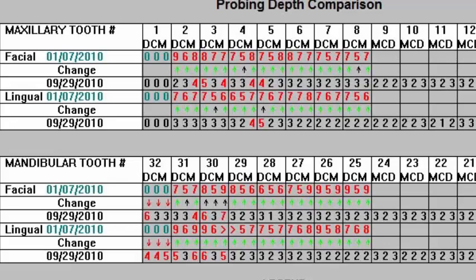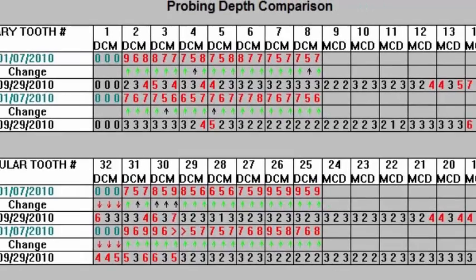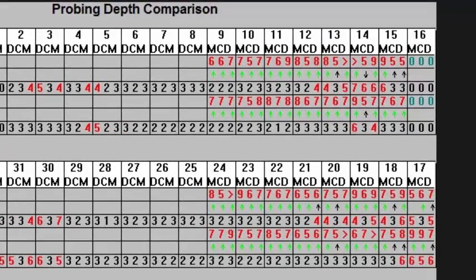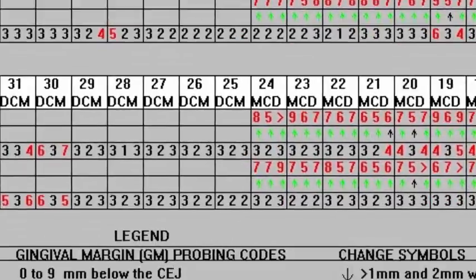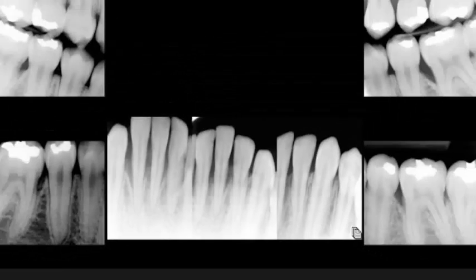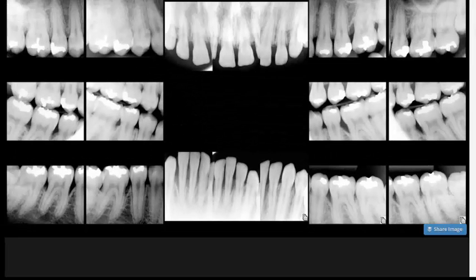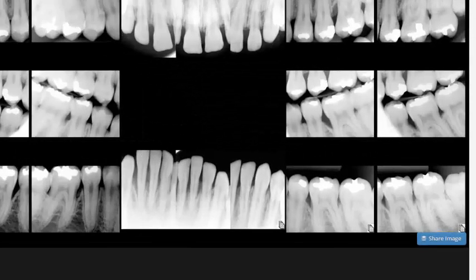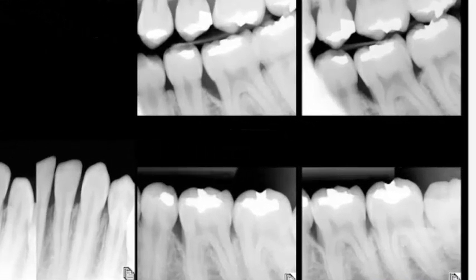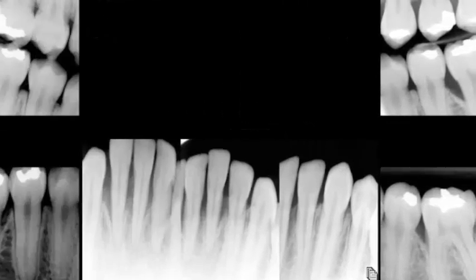These are the x-rays of the case, and this is also diagnostic. You can see these vertical defects in the anterior segment and then also on these first molars — these almost go straight down.